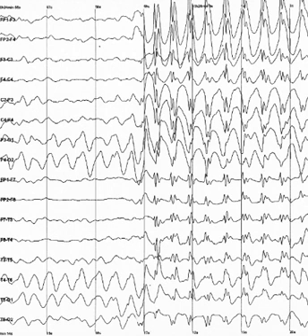Diagnostic applications generally focus either on event-related potentials or on the spectral content of EEG. The former investigates potential fluctuations time-locked to an event like stimulus onset or button press. The latter analyzes the type of neural oscillations, popularly called brain waves, that can be observed in EEG signals in the frequency domain. EEG is most often used to diagnose epilepsy, which causes abnormalities in EEG readings. It is also used to diagnose sleep disorders, depth of anesthesia, coma, encephalopathies, and brain death.